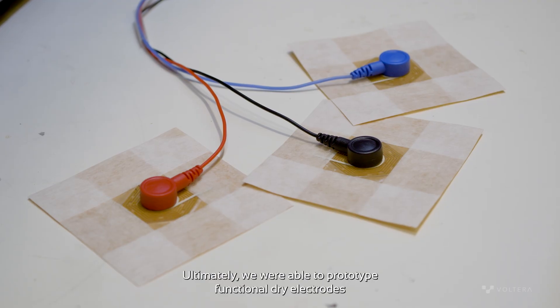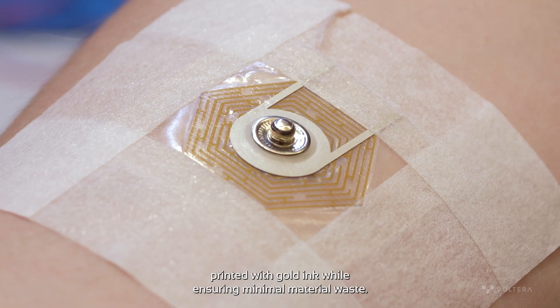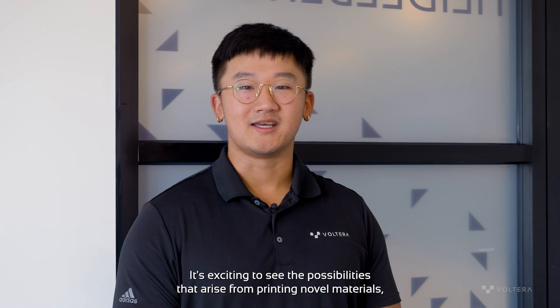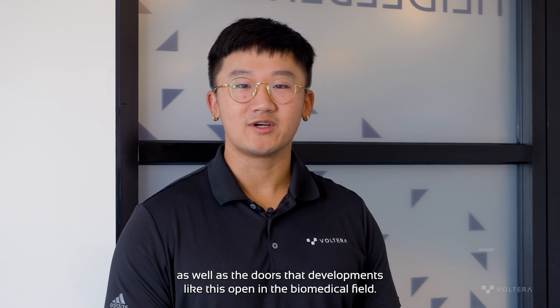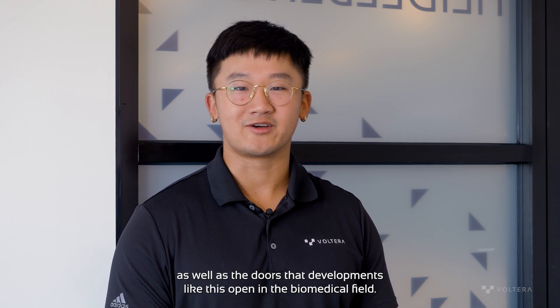Ultimately, we are able to prototype functional dry electrodes printed with gold ink while ensuring minimal material waste. It's exciting to see the possibilities that arise from printing novel materials, as well as the doors that developments like this open in the biomedical field.